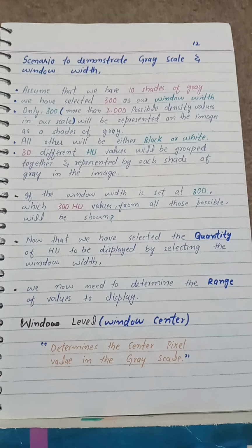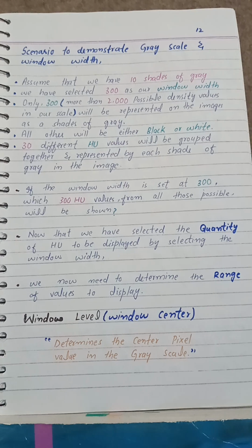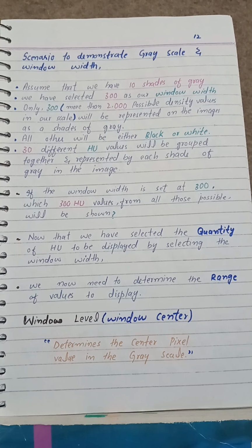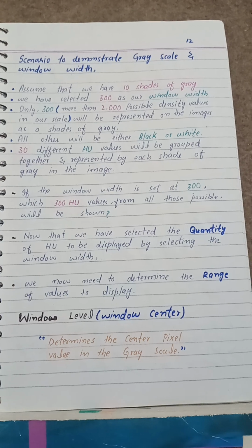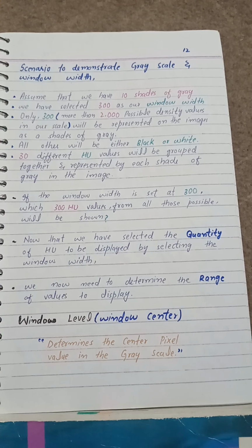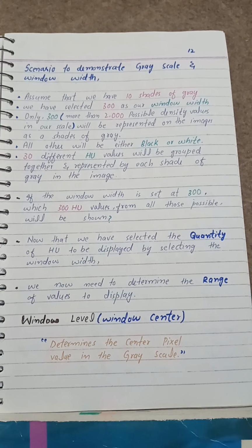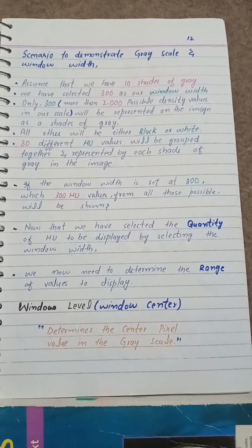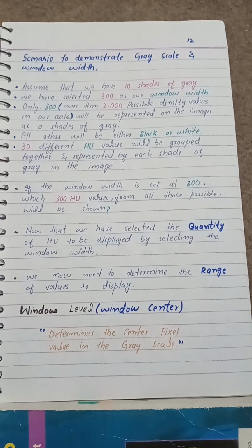Scenario to demonstrate grayscale and window width. Assume that we have 10 shades of gray. We have selected 300 as our window width. Only 300 of the more than 2000 possible density values in our scale will be represented on the image as shades of gray. All others will be either black or white. 30 different Hounsfield unit values will be grouped together and represented by each shade of gray in the image. If the window width is set at 300, which 300 Hounsfield unit values from all those possible will be shown?